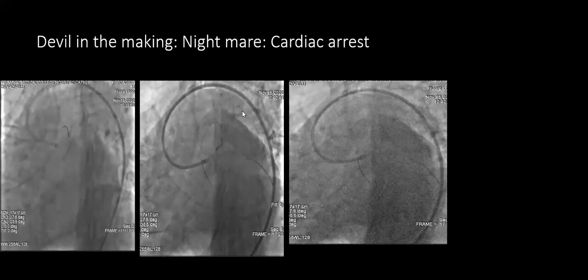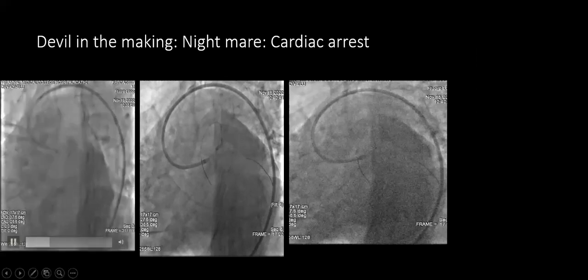I asked for a 3 mm scoring balloon, but there was no 3 mm scoring balloon. I took 2.75 mm. But you see the waist here. This waist was not going. 2.75 into 10, we went up to, and this balloon ruptured. You can see the waist was not giving, it ruptured. Again, he developed slow flow. Again, all cocktails, everything.